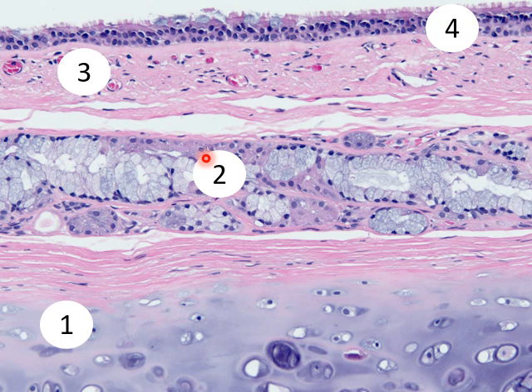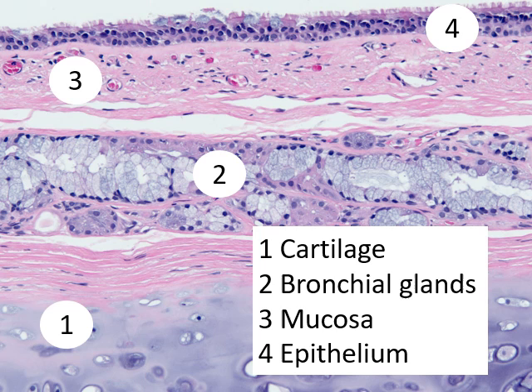These glands have a duct that opens onto the surface, connecting with the lumen of the bronchus. Number three is the mucosa — or mucosa and submucosa combined. The small dot circles are capillaries, with red blood cells inside. The pink material is collagen, and the small nuclei are fibroblasts. Number four is the surface respiratory epithelium.